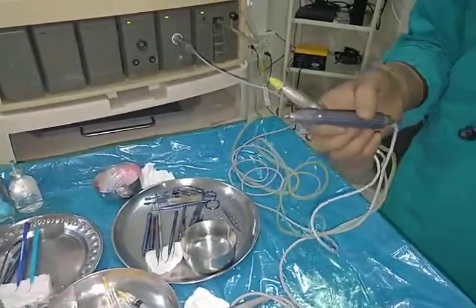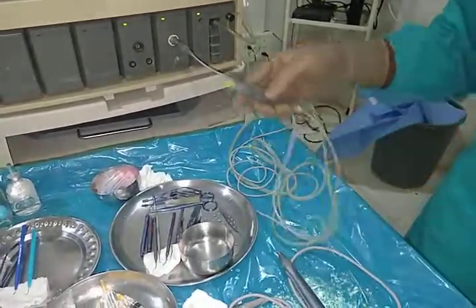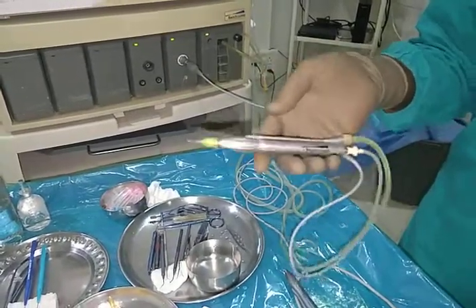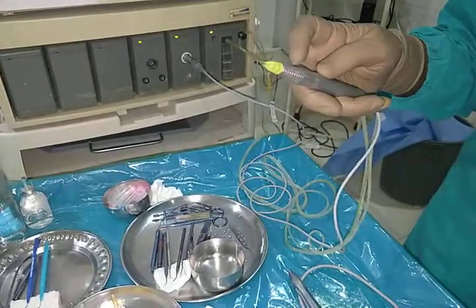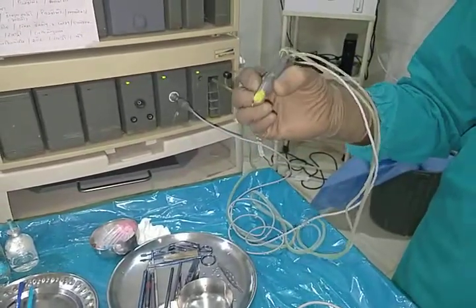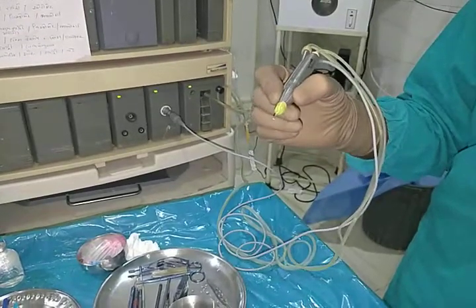Why have we done all this? I just want to show you both handpieces. There are two or three differences between these two handpieces. First, this Stellaris handpiece is very lightweight and thin, and it has a grip so you can grasp this FECO handpiece while doing surgery very well.